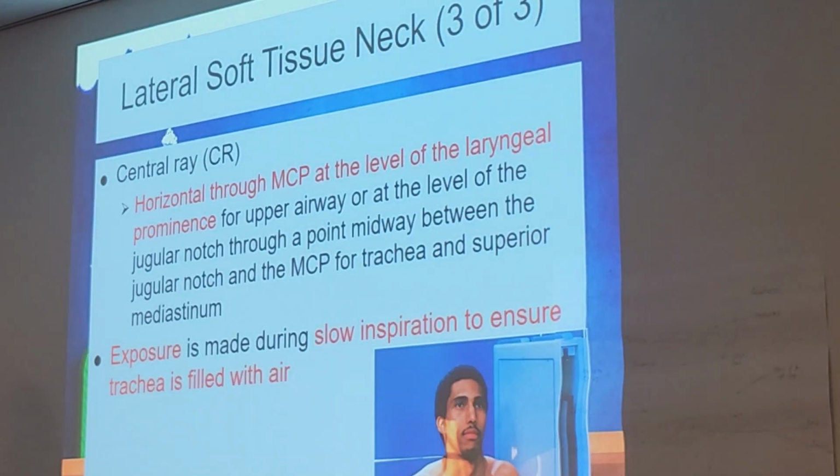And of course, central ray, guys, is still at the level of the laryngeal prominence, but going through that MCP. Don't forget those small details like MCP, MCP coronal. And then same as the AP, guys. Seems like common sense, but people miss this small little fact.